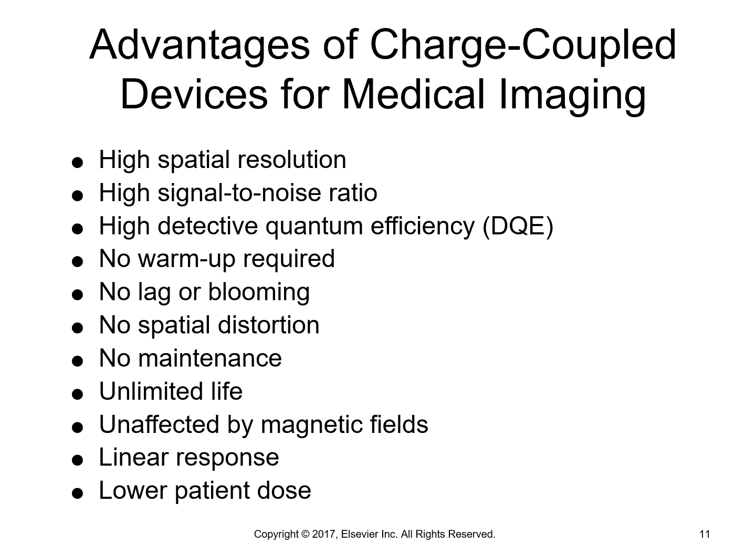Okay? So the CCD had improvements in efficiency from a conventional television camera. So it's got a better signal to noise ratio. It doesn't generate as much noise as the old television camera technology did. Okay? High detective quantum efficiency. Now this is a digital imaging term. You're going to be quizzed on this in the next class in digital imaging.